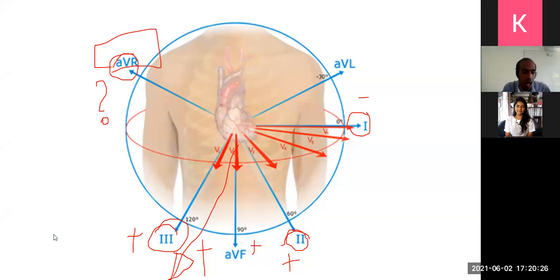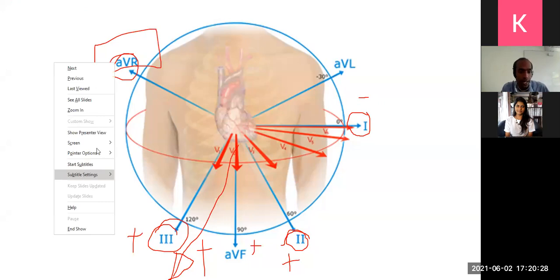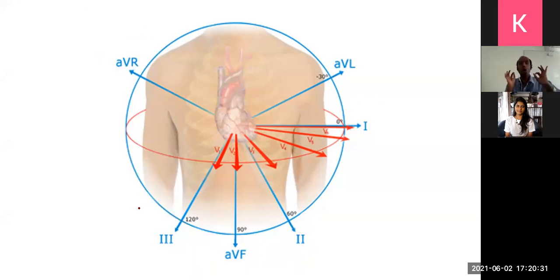So that is just how you would determine the cardiac axis then. So what is the axis? The axis is a summation of all the electrical activity in the heart, number one. To determine the axis, you definitely need this picture. Without it you cannot determine the axis. That's why I started off by teaching you the lead orientation. Taking the lead orientation: anterior surface of the heart V1 to V6, left side 1 and AVL, inferior 2, 3 and AVF, right is AVR. So this is the orientation of the leads, right?